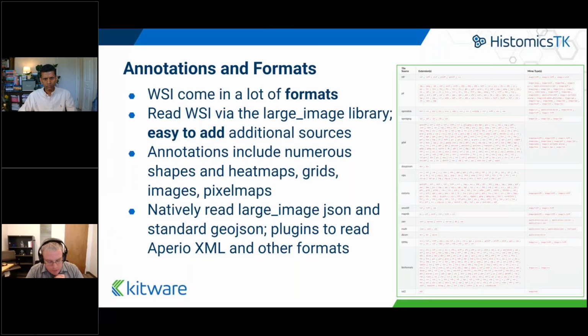Formats. We would love for the whole slide images to be in something more standardized, but that's not the way the world is. And so literally there are hundreds of variations of formats. There are some basic formats like DICOM and TIFF. There are some things that look like they might not be those, but are like Aperio SVS or just a type of TIFF. And OME TIFF is yet another variant. And TIFF is a whole wide structure, but there's all these other things, Zeiss files and Nikon files and files that come from other sources.